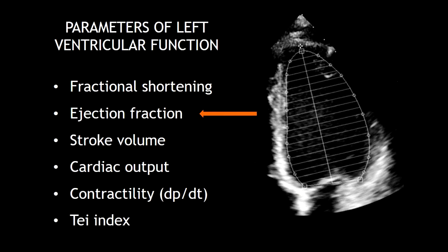The left ventricular function is very important, but sometimes it might be difficult to assess. All these parameters are recommended to assess the left ventricular function. However, in this video, I'm going to talk about the ejection fraction by Simpson's method.